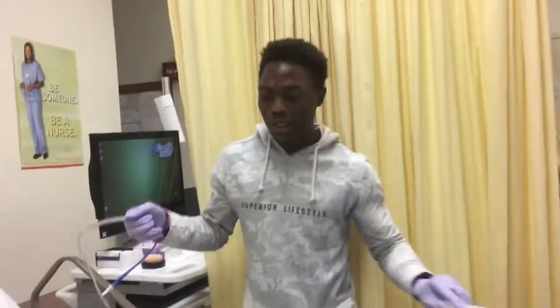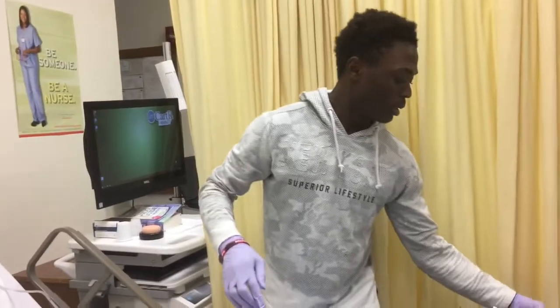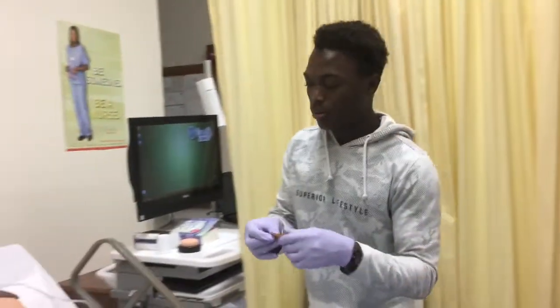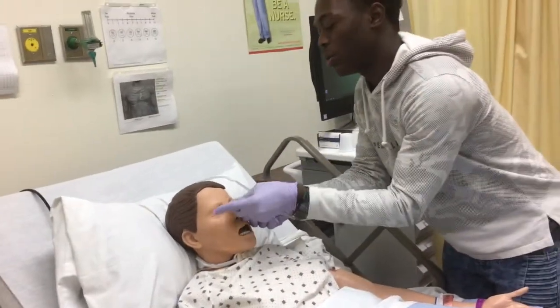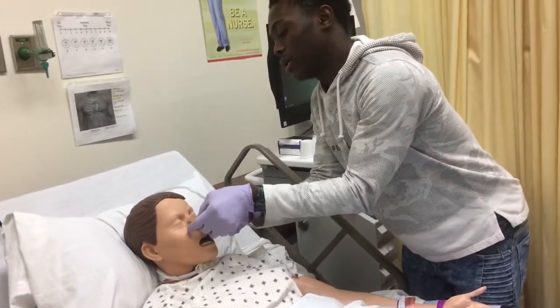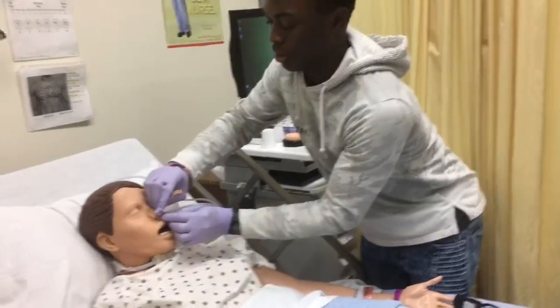And after you are done with that, you want to secure the tube around the patient's nose. So to secure the tube, this part is gonna go on the patient's nose, and this is gonna go around the tubing.